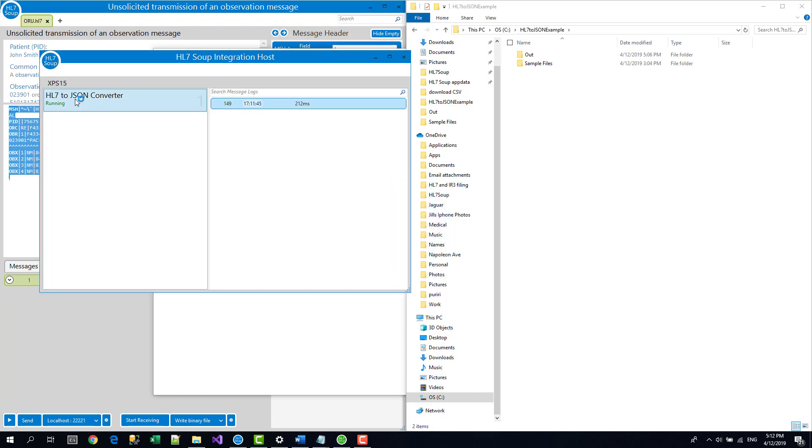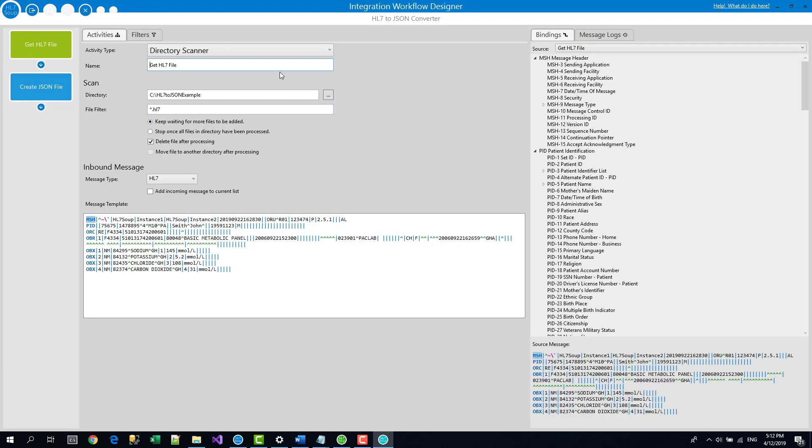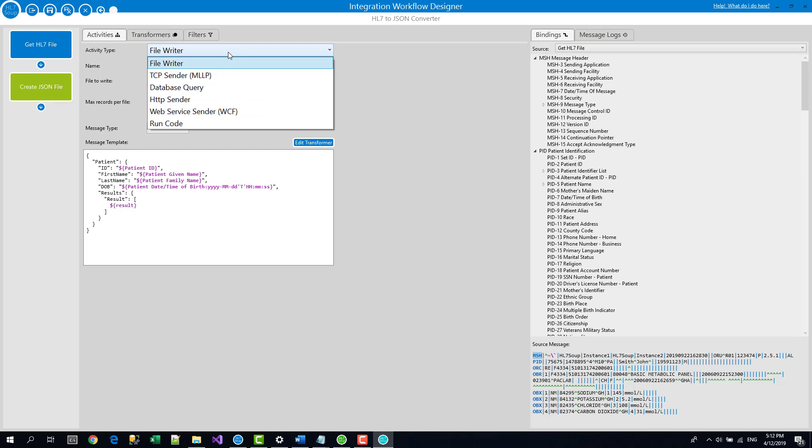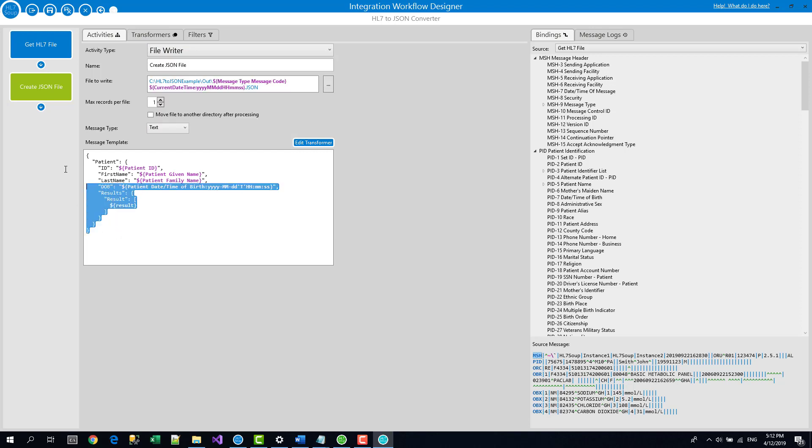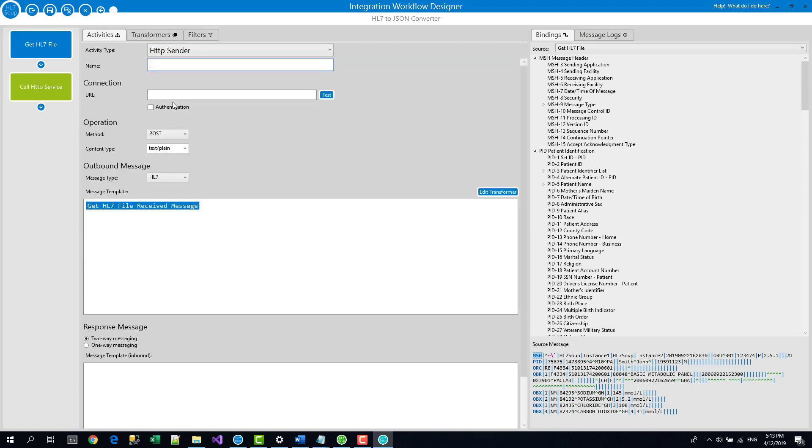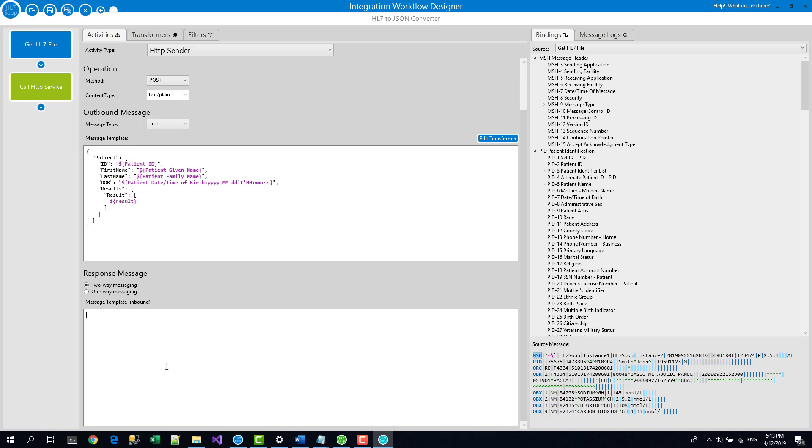Another thing that you might want to consider keeping in mind that this is a JSON file. Why do you want a JSON file? It might be that you didn't want to write it out as a file. Perhaps you were better off actually sending that off to perhaps an HTTP sender or a web service sender. Let me just drag that. Copy that. Change it to HTTP sender. And here's our message again. I'll populate that. And we can use all this. We'll populate a URL and all the stuff. Post it off. Again, make it text. And then you can get a response. So this is a way it could call your web services or what have you. I haven't actually got a web service or anything that I can call. But I just wanted to give you an idea that that's possible. It doesn't just have to be spit out as a file. So hopefully that's helpful for someone.